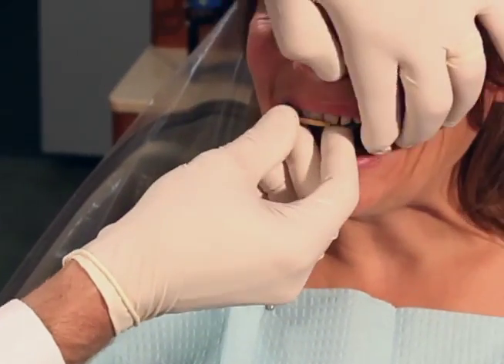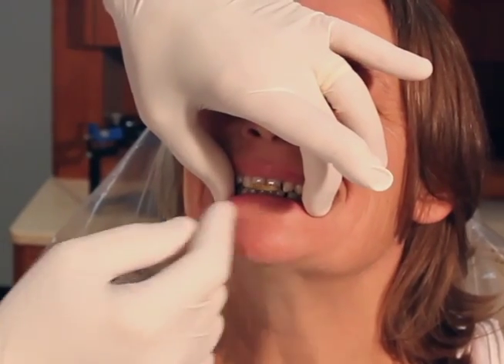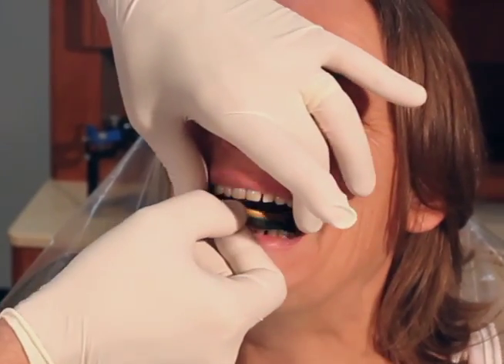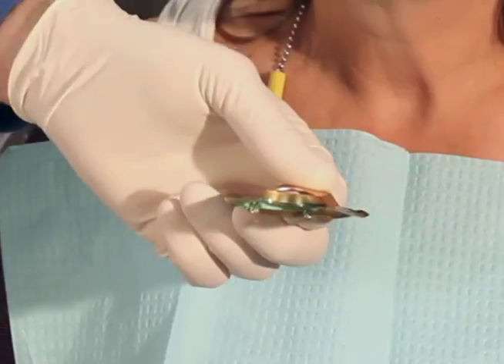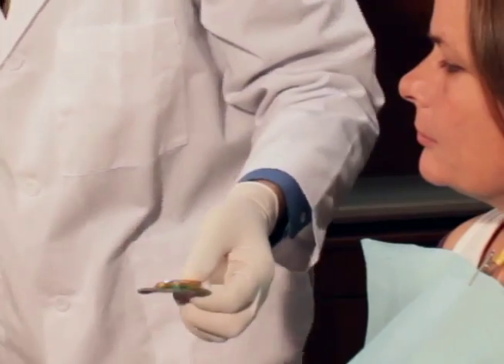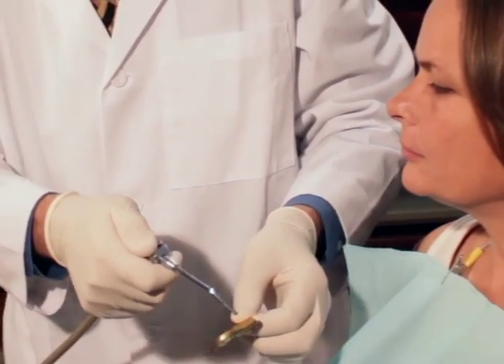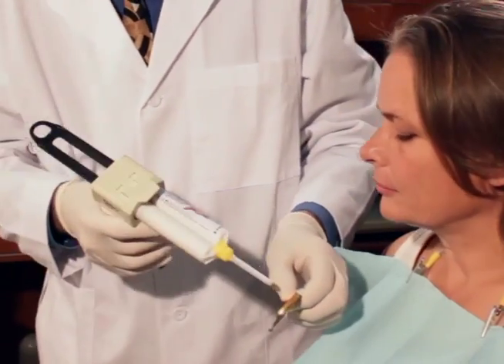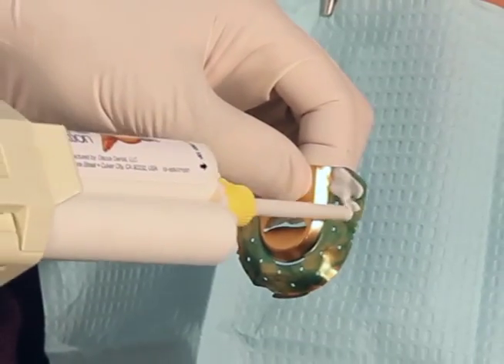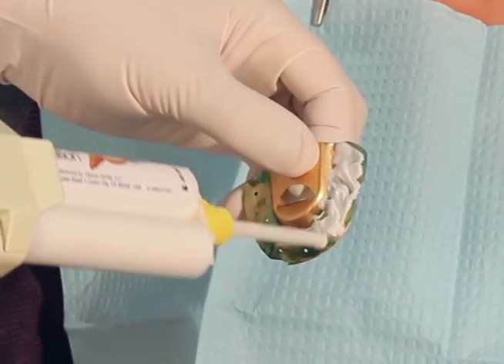Line up the dental midline on the front of the bite tray to the dental midline. Have the patient bite up and crush the tray. This will now form the tray to the occlusal surface better to minimize the amount of opening of the centric record. We can now air dry the upper side again.